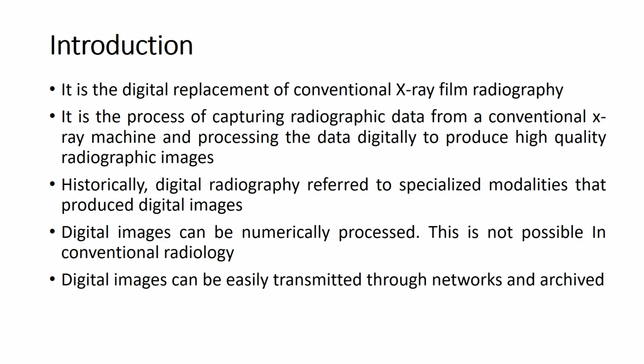So, digital radiography historically refers to a specialized modality that produces a digital image. Digital means we can numerically process the X-ray images or the radiograph.